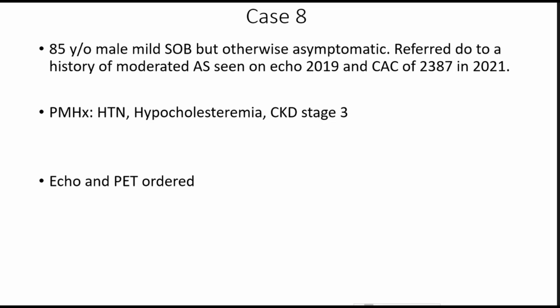That is known to have a better sensitivity and specificity for abscess in the setting of the concern for endocarditis. So between the two, you have a couple options, but definitely agree that if we're really looking for active infection in the setting of prosthetic valves, I think a cardiac PET CT is probably our best option.